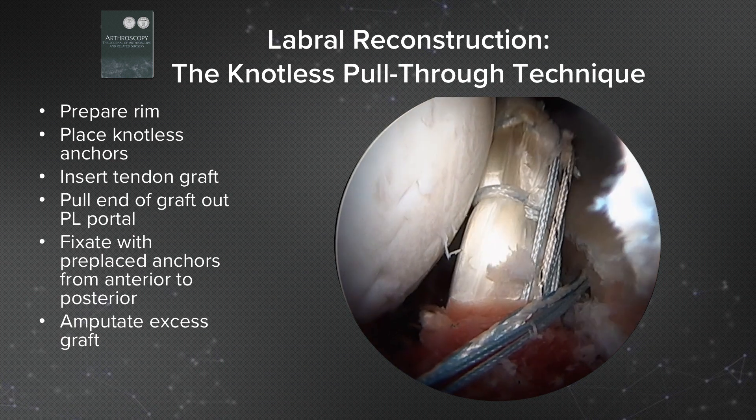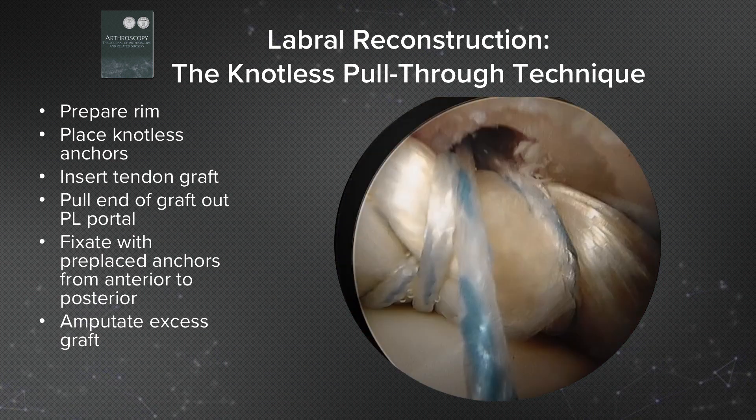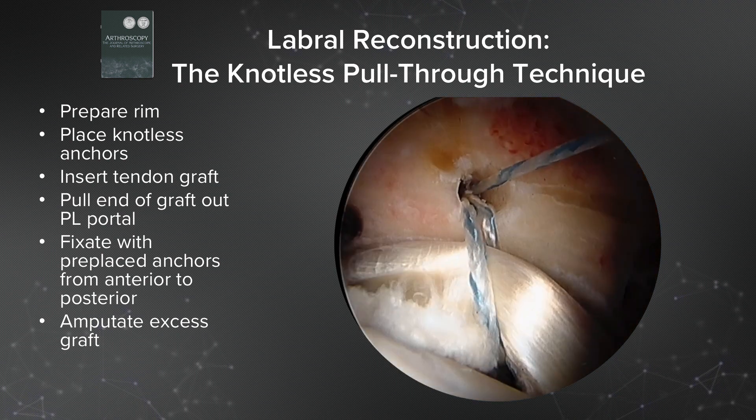Next, we shuttle the tendon graft into the joint. In this case, this is a tibialis anterior graft.